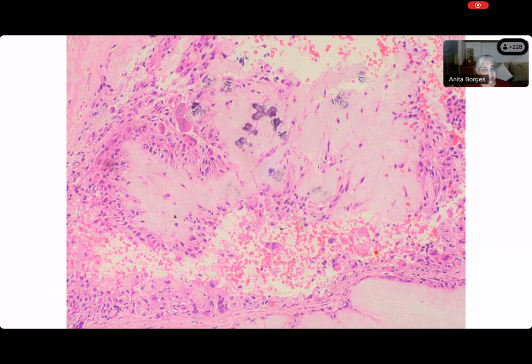Prayas has again raised his hands, but let Mansi answer, then Prayas, you can. Inflammatory epithelioid kind of cells. Some are epithelioid-like cells, very good. But you said inflammatory epithelioid-like cells. So would you like to tell me which epithelioid cell you're thinking about? If these are epithelioid-like cells, and you are on the right track, Mansi, what epithelioid cell are you thinking about? All right. Before I ask, let me ask Monica, what epithelioid cell is Mansi thinking about?